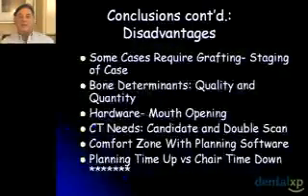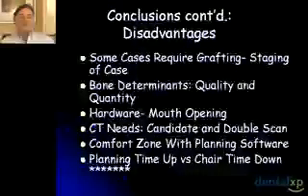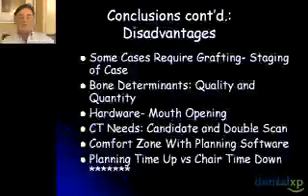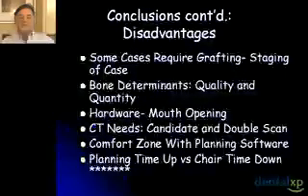For the hardware, or the mouth opening, you need at least 40 millimeters of opening. You can check the patient out. I personally have never had a problem that I couldn't get the instrumentation in. If you have a posterior case and it's a little bit long, what we do on those patients is we drill the site to depth using shorter drills. Then we install the actual length drill we're going to use into the osteotomy, then hook up the handpiece, and we save 5 to 6 millimeters that way.